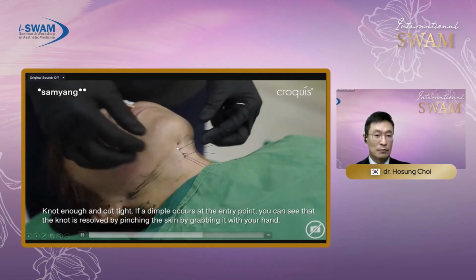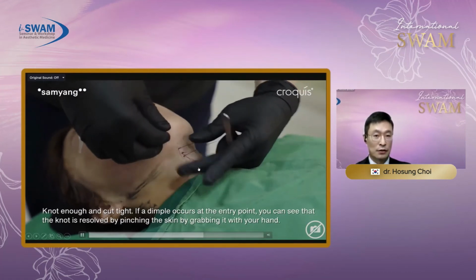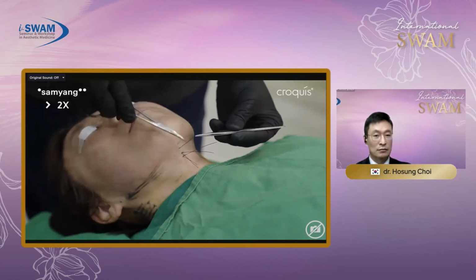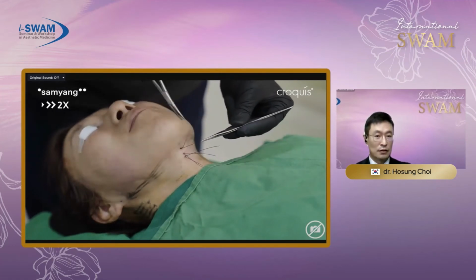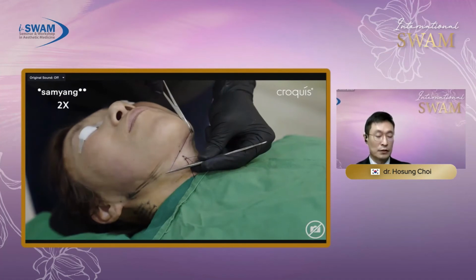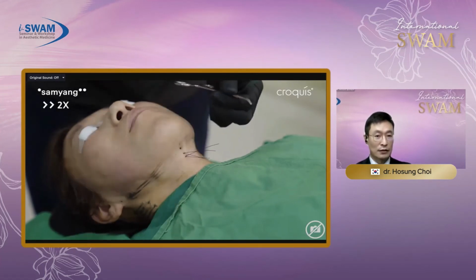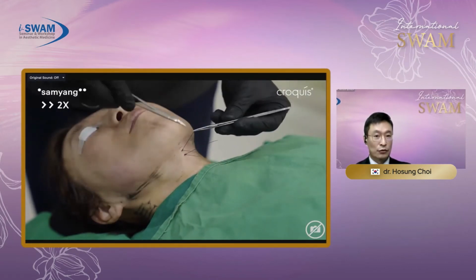And then there will be some dimple because the knot is still exposed. You can just pinch the skin symmetrically, and usually the knot goes inside underneath the skin. So the dimple is usually easily resolved. That's why I prefer to use thin threads, not too thick, which is about USP 2.0.